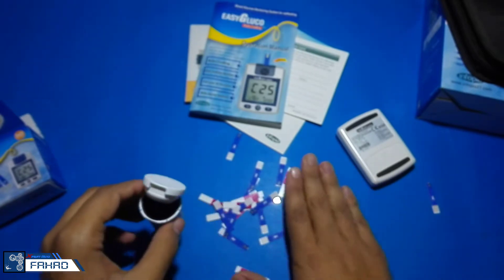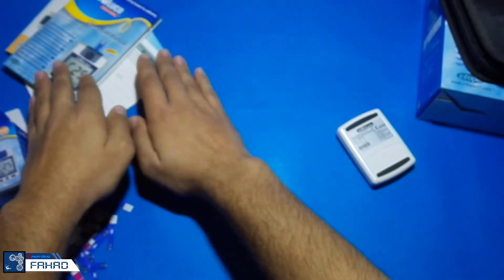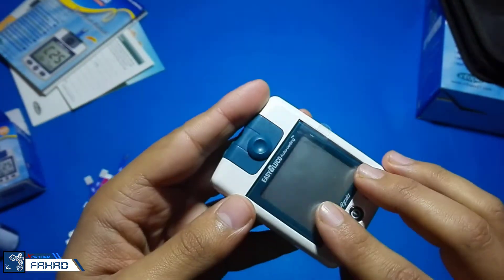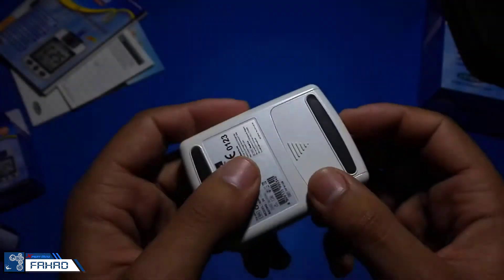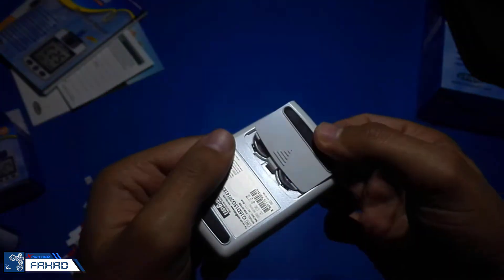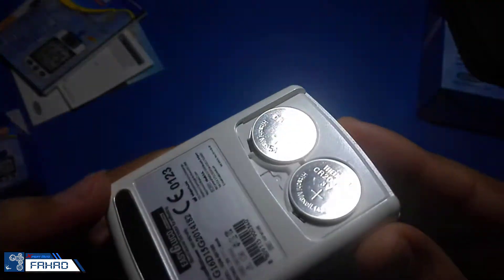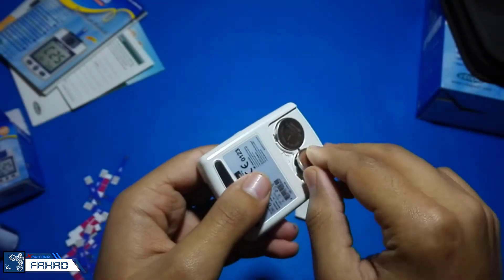Now I am going to take apart the glucose meter. First I am going to remove the batteries. It consists of two batteries, both 3 volts, and they are used in parallel, because the input needed for this glucose meter is only 3 volts.